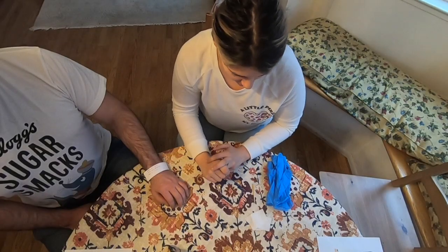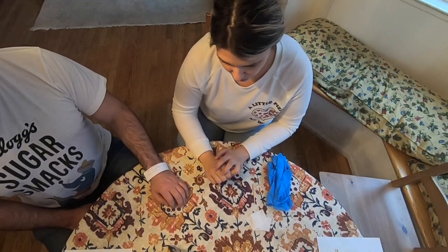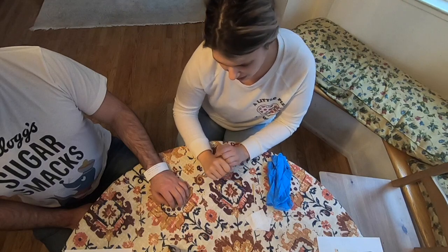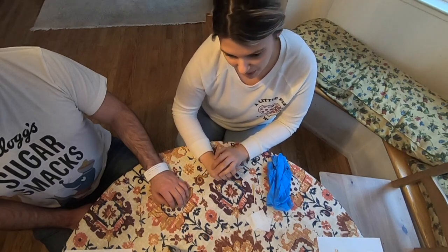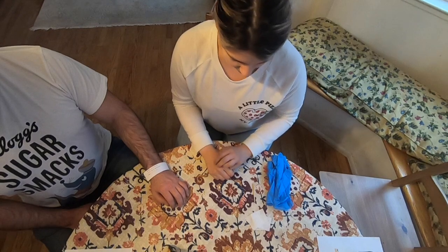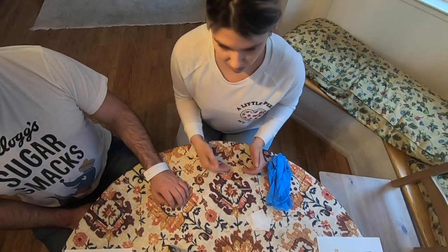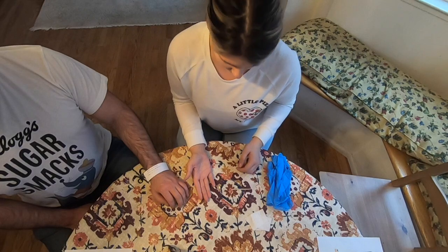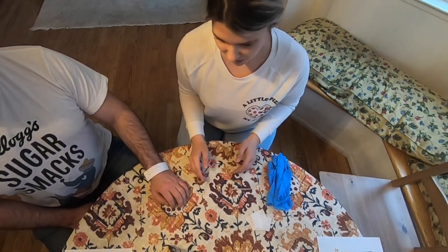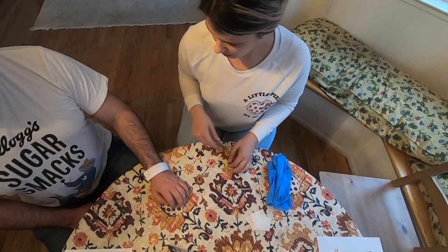Subcutaneous injection administration: at this time I have entered my patient's room, identified myself, performed hand hygiene, asked the patient for their name and date of birth to confirm my check, and double-checked the medication in the syringe with our EMAR once again — everything has been correct.